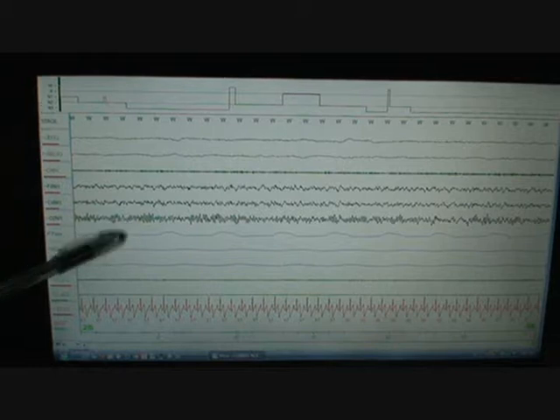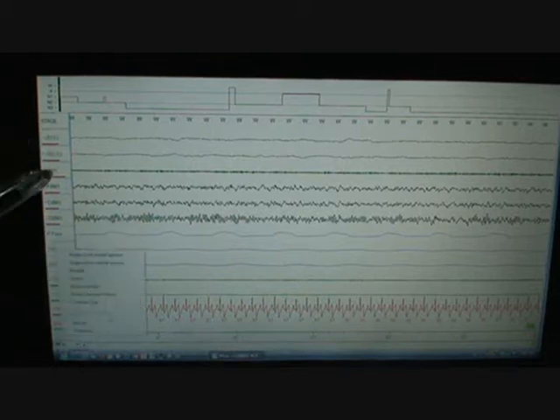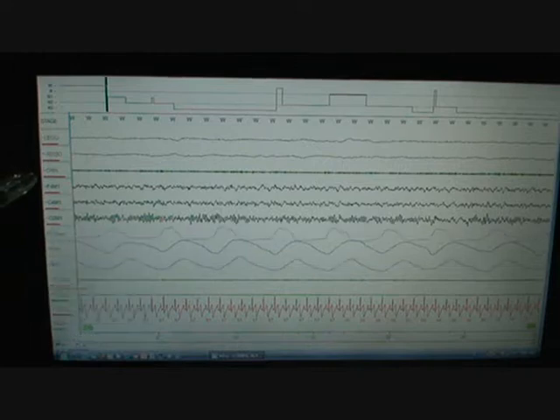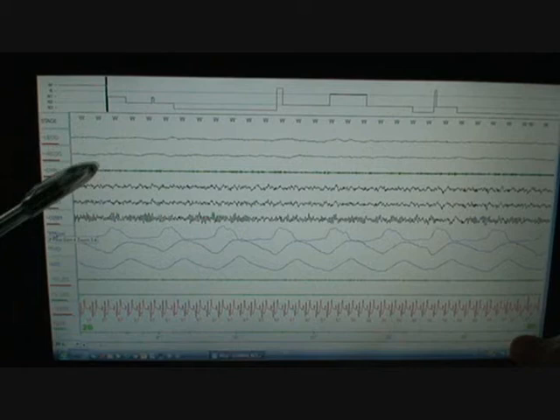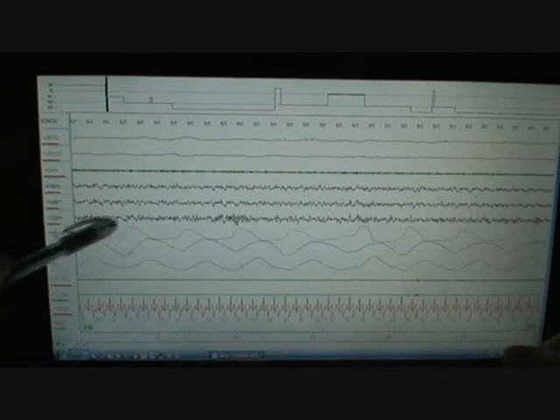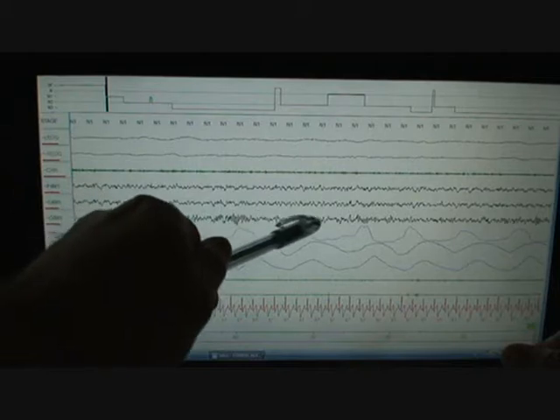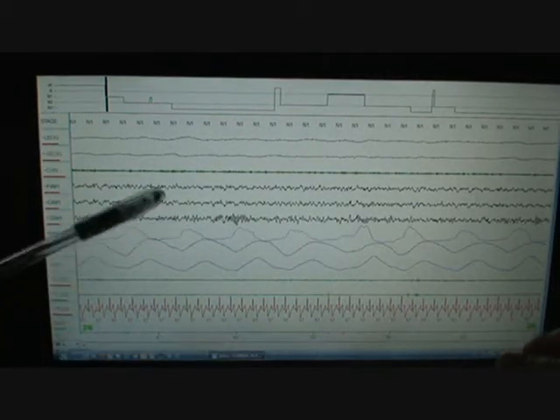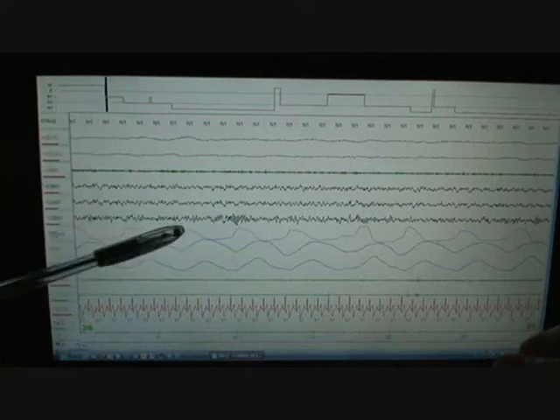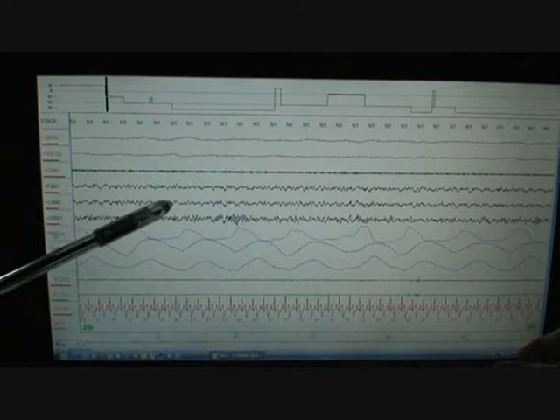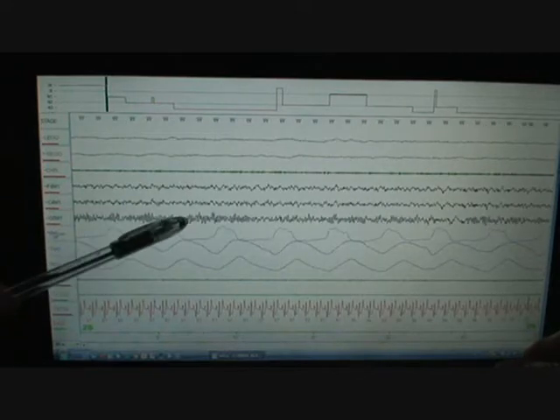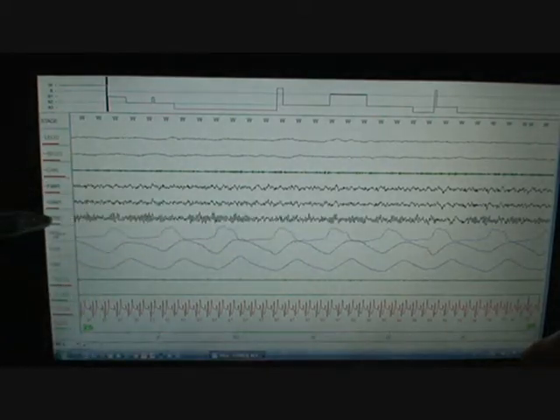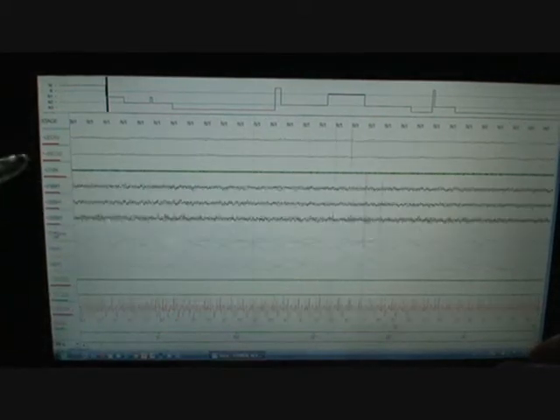So right now you can see that their eyes are closed, they're relaxed. Everything's pretty stable. The breathing is normal. So what we're looking for is for this to diminish, the alpha to diminish. This next page, you can see the difference. Now it's much slower. You can see some space in between these. The frequency is now below eight cycles per second, which means sleep. The eyes are slow and rolling and you can tell they're pretty relaxed. So you can see the difference. This is wake, and now that's sleep, sleep onset.